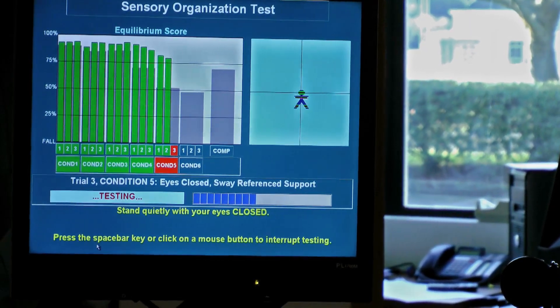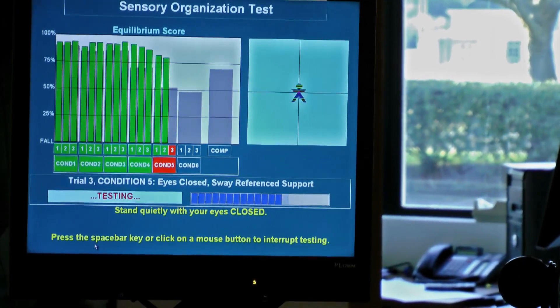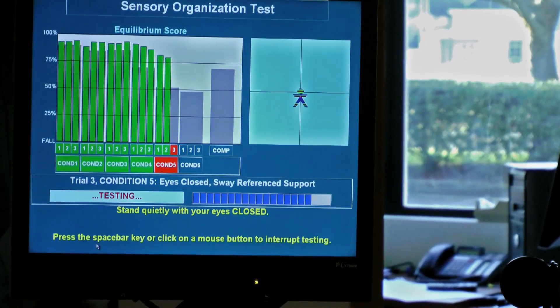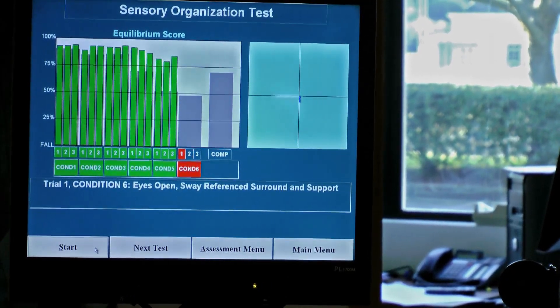She's actually doing very, very well on this test. The gray area you might see on the computer represents the abnormal range, and she's way up above that. The green lines represent good performance.